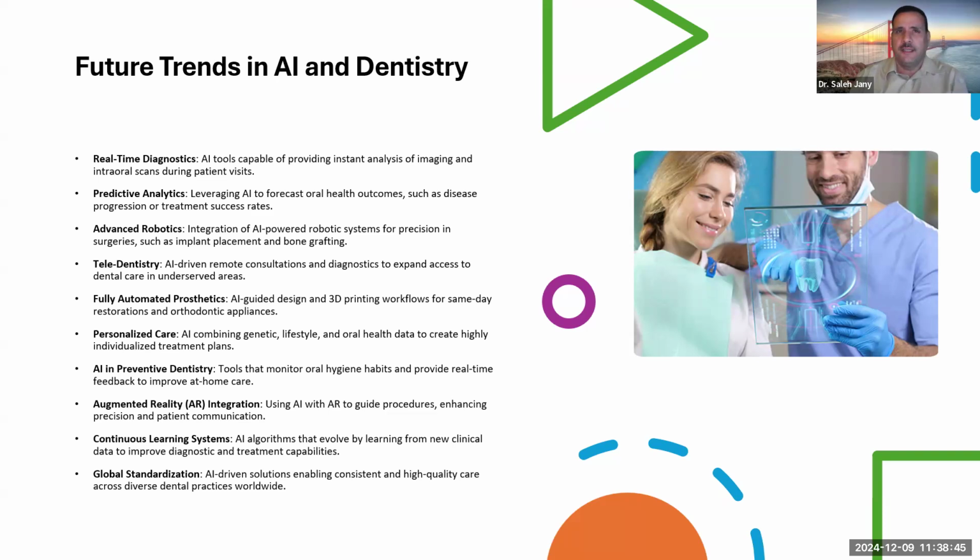Invisalign nowadays has a problem, because some dentists hate Invisalign, because Invisalign can now access the patient without the dentist. They send the patient impression material, and the patient takes the impression by themselves, and then sends it back to Invisalign. Invisalign will scan it, and they might make the appliances, a retainer, and they might skip the dentist in general, and the dental lab technician. But it still needs more regulation and more knowledge about this, as it's still in the beginning.